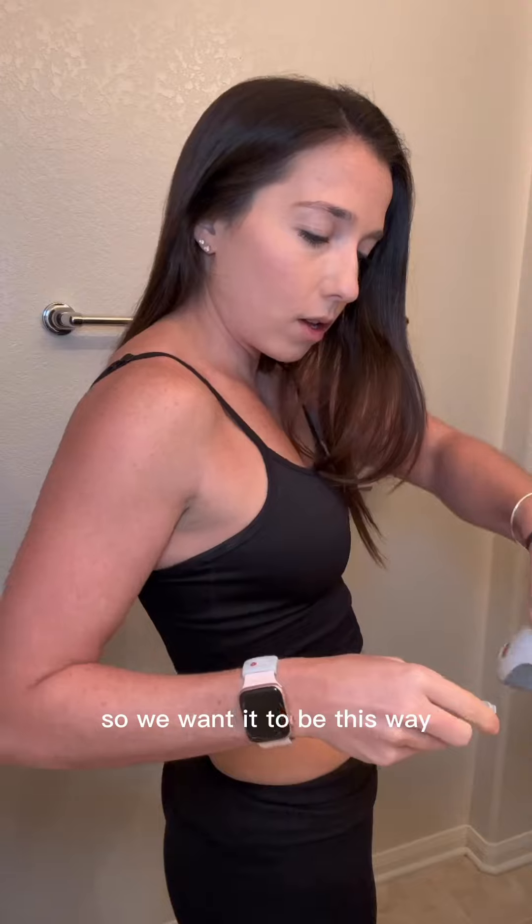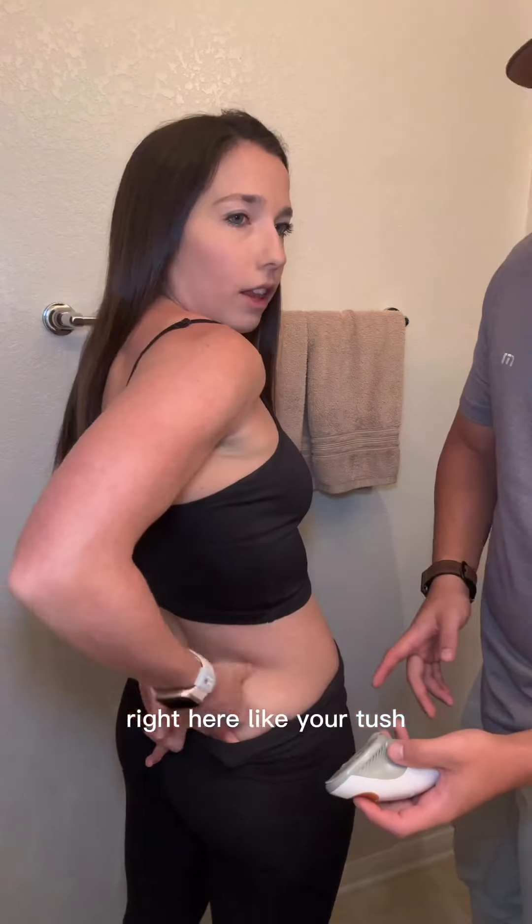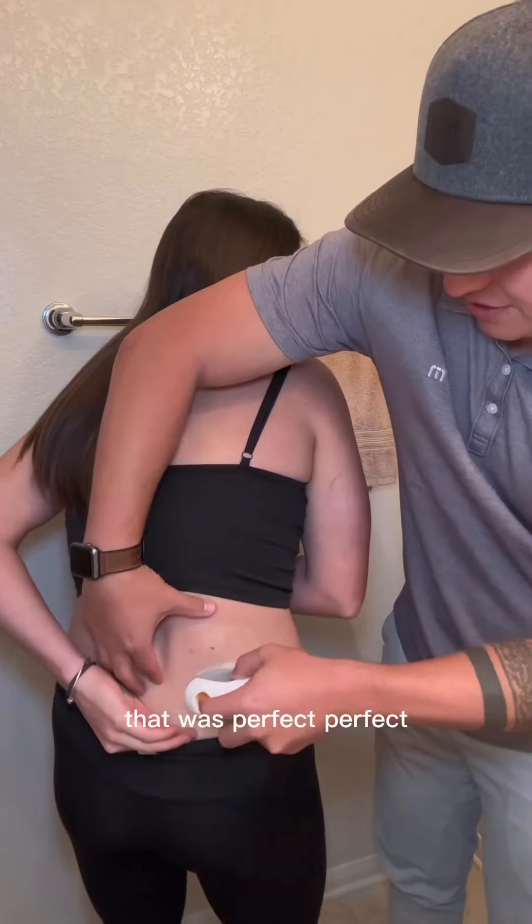Let's change my Dexcom. I'll call white. Can you do it here? Right here? Like at your tush? I think like here. There. Alright, not changing now. Oh gosh. That was perfect. Perfect.